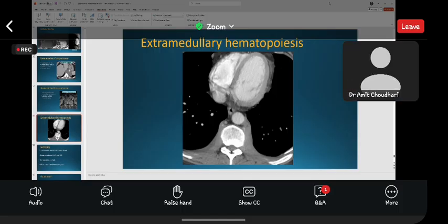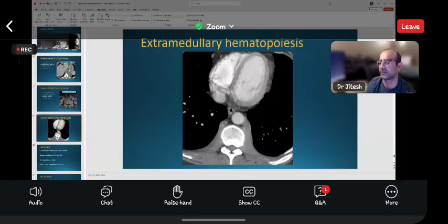Thank you. That's quite helpful. There's another question. What is the difference between thymic carcinoma and invasive thymoma? Perhaps to know whether it can be differentiated on imaging. Yeah, so both are thymic epithelial neoplasms. These are pathological diagnoses, invasive thymomas based on the grading of the thymomas, and the thymic carcinomas. So on imaging, differentiating invasive thymoma from thymic carcinoma is a pathological diagnosis, right?